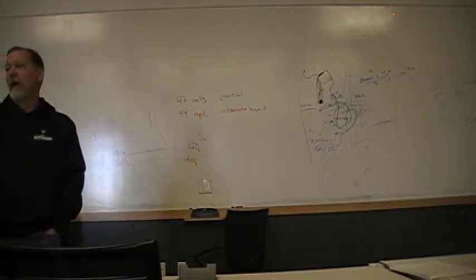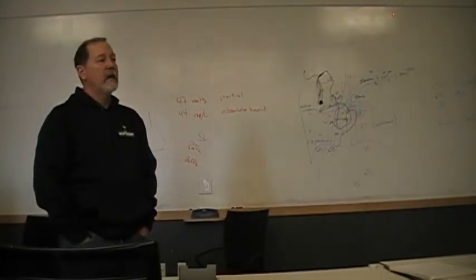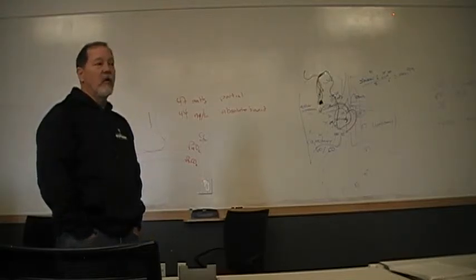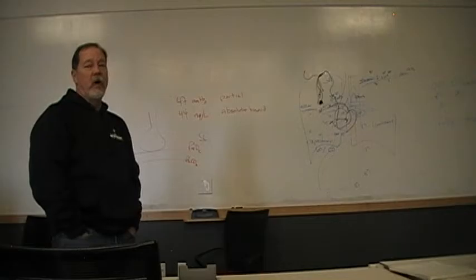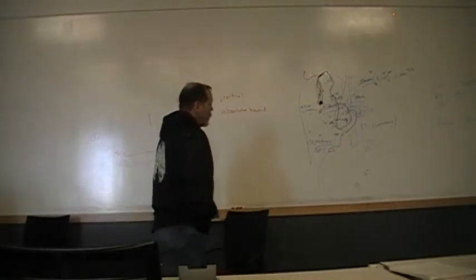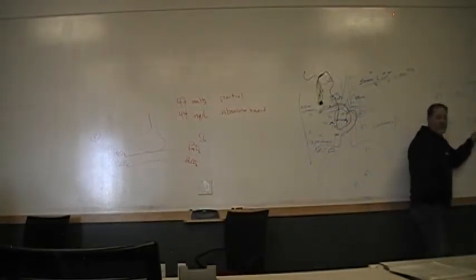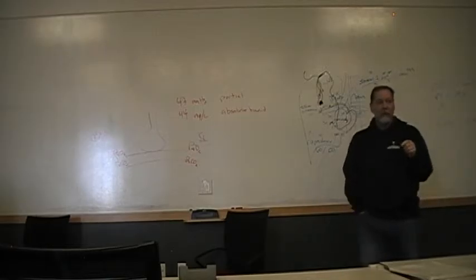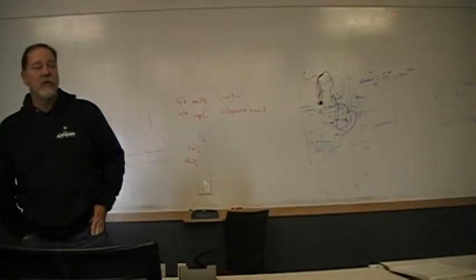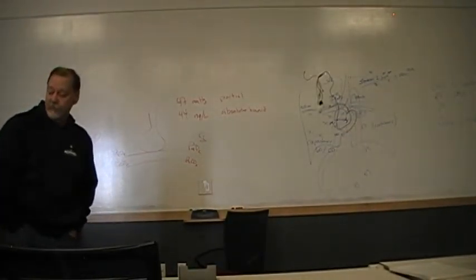You know, a fairly routine post-op may not have a Swan-Ganz catheter. These are patients that are critical in circulating volume that would have a flow-directed pulmonary artery catheter, or a Swan-Ganz. So when that catheter is wedged, it's called pulmonary capillary wedge pressure. 8 to 12 millimeters of mercury is about normal. Lindsay Jones and others may go a little bit lower, but a lower wedge pressure is associated with low circulating volume. Okay.